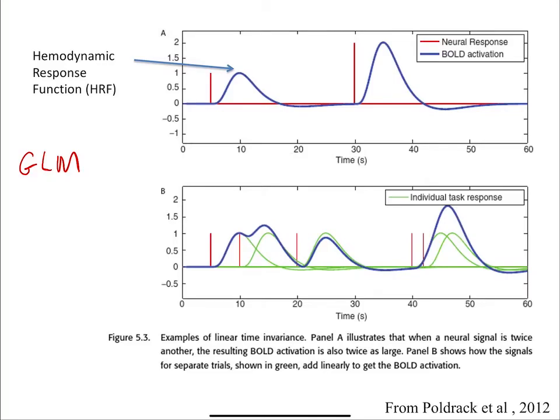Today we're going to be talking about single subject analysis. Basically you put the person in the scanner, you do some scans on them, and how do you analyze each of those scans? In later weeks, Alan Simmons and others will be talking about group analysis. For today and tomorrow, we're simply talking about single subject analysis, also called first level analysis. When you hear the term single subject, subject level, or first level, those all mean the same thing. You have 10 minutes of fMRI data. How do you analyze it? And what are you hoping to get out of that?